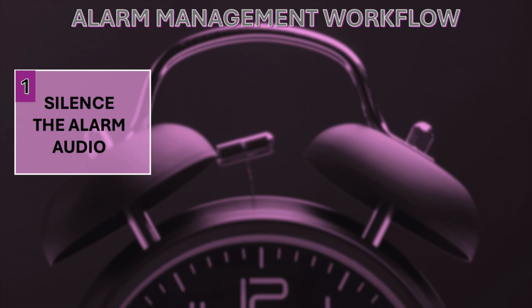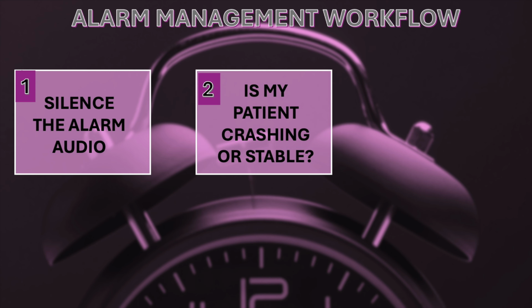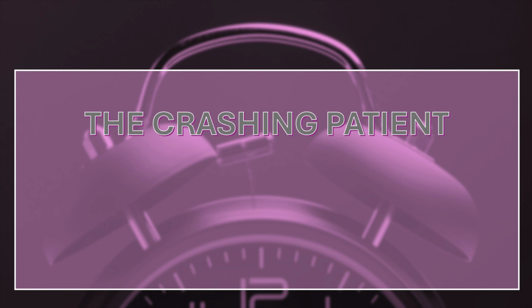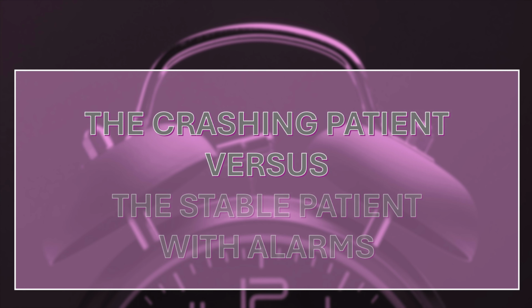In step 2, assess the situation and ask yourself, is my patient crashing or stable? You've just asked the most critical question in alarm management. Promptly seeking an answer to this question, followed by the appropriate response, improves patient outcomes. First, let's define the crashing patient with alarms versus the stable patient with alarms, after which we will detail the remaining workflow steps for both patient types.